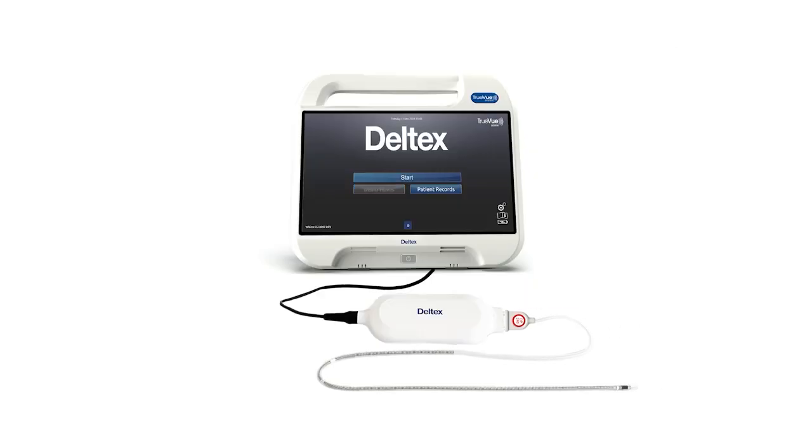Plug the Deltex medical probe into the DOP link. If existing data is already on the probe, the monitor will display a message asking if you wish to continue. If there is no data present on the probe, the Start button will become active. Once pressed, the user will be presented with a patient data screen.